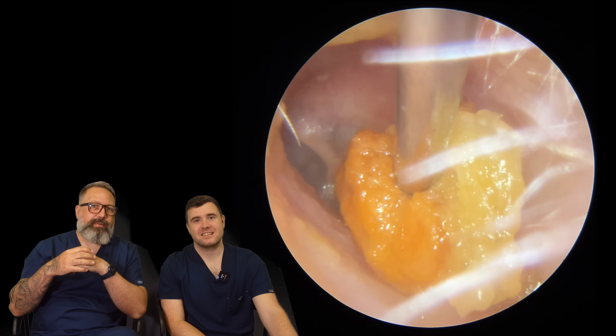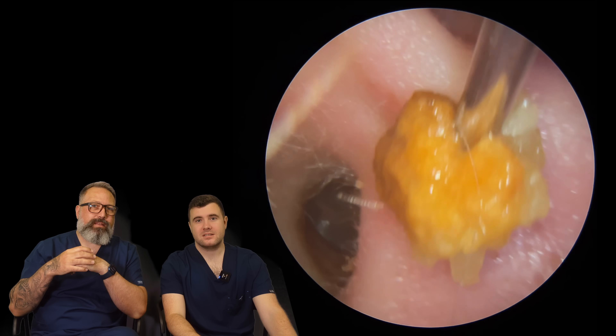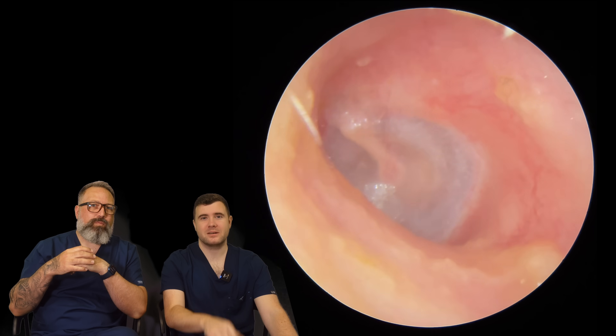There we go. Look at that coming away. There we are. Perfect. Nice and sludgy. Nice and easy. Nice and quick. In and out.